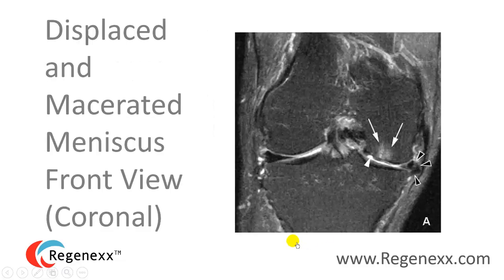A displaced and macerated meniscus is shown here in someone with no cartilage on this compartment. The other side has a normal dark triangle meniscus with a little bit of thinning cartilage, but this side has very little cartilage. The bone is bright, meaning the bone is getting bruised and likely has small fractures within it. The meniscus here is pushed out of the joint, has lots of white in it, and is macerated — meaning it has lots of different tears.